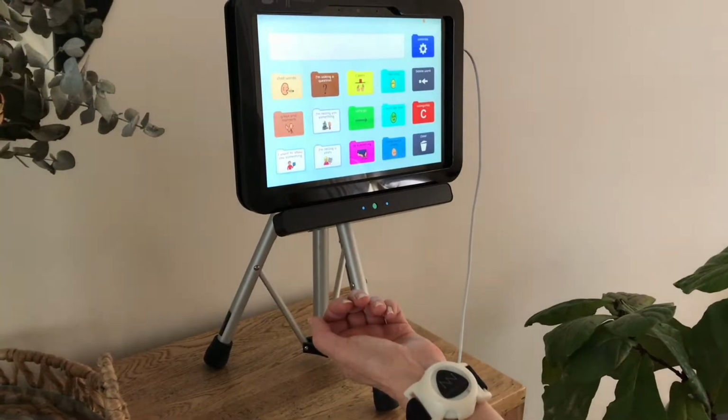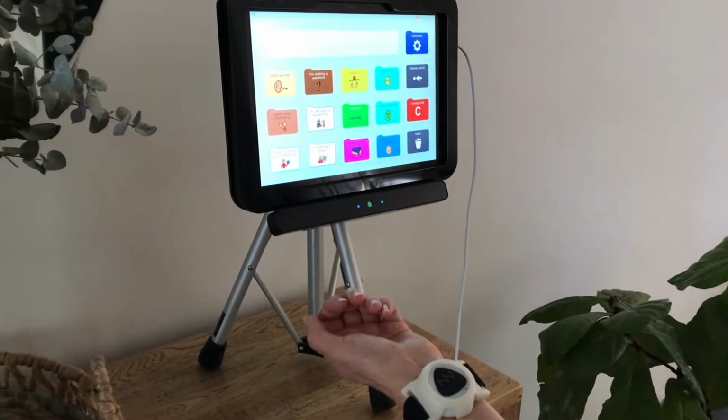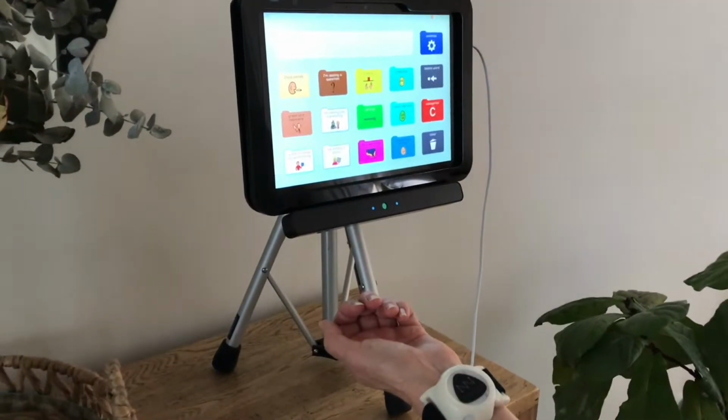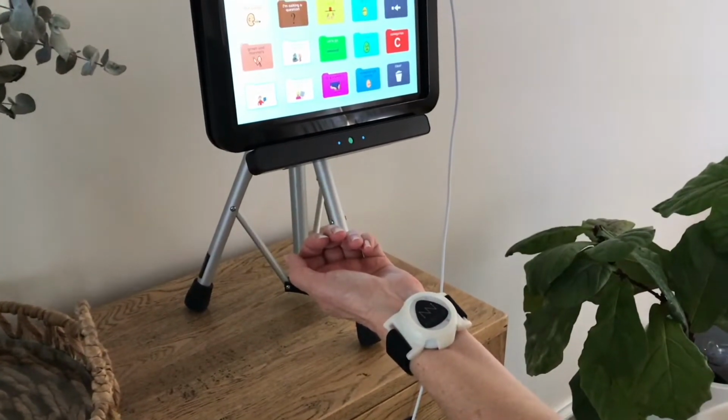This is a video on partner-assisted auditory and visual scanning. So in this video we have me, and I'm the partner, and we have our communicator, and she's wearing the neuronode. The neuronode is a type of EMG switch.